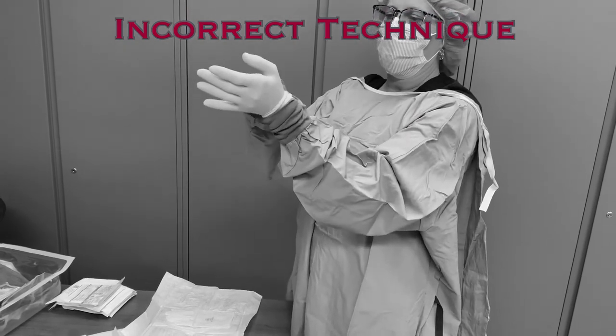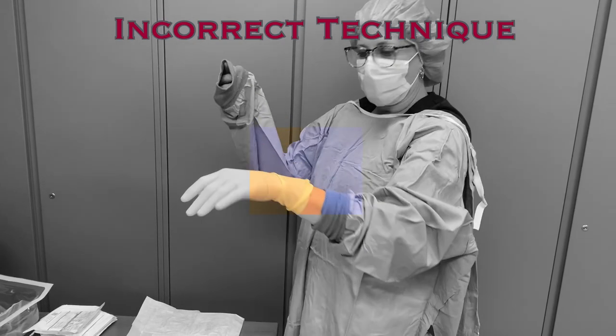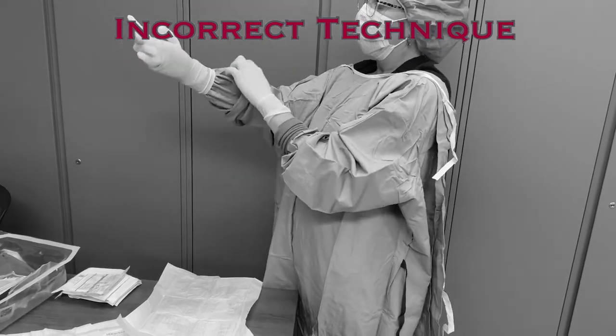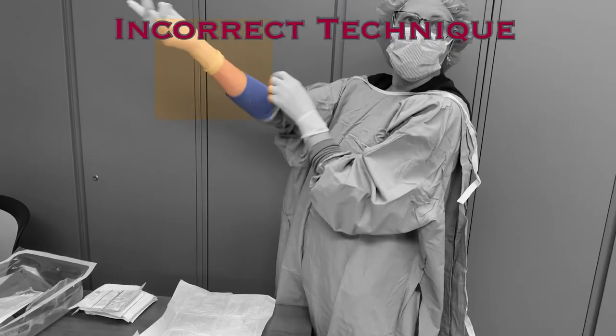It is also likely that when the glove is pulled over the hand, the sleeve will slide down and not be contained under the glove, leading to a gap between the glove and the gown, which will leave non-sterile skin exposed. Another problem to be aware of is that if the sleeve is pulled back too forcefully when applying the glove, it can slide out from under the glove, again leading to the reveal of non-sterile skin and probable contamination.